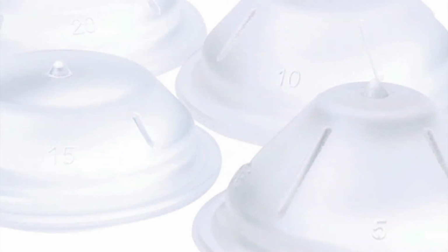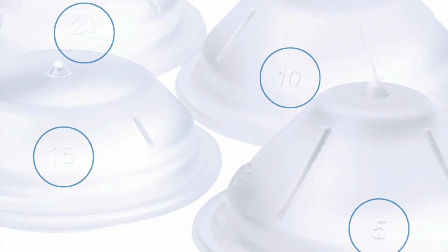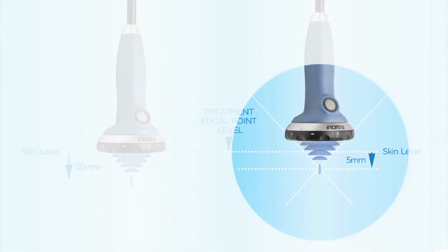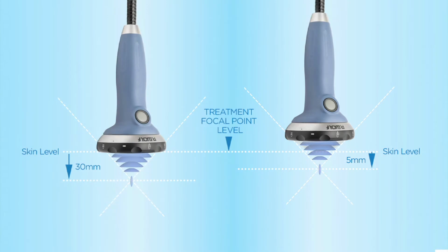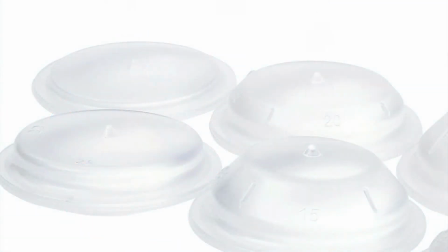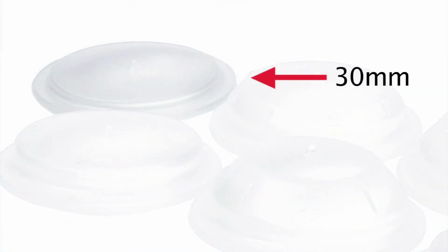The number on the gel pad indicates the penetration depth of the therapy focus in millimeters. Using a taller gel pad results in an incrementally shallower depth of penetration. The maximum possible depth of penetration is approximately 30 millimeters, which is achieved by using the highest numbered pad, which is 30, the flattest gel pad.